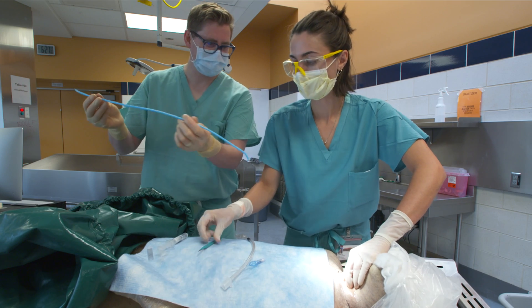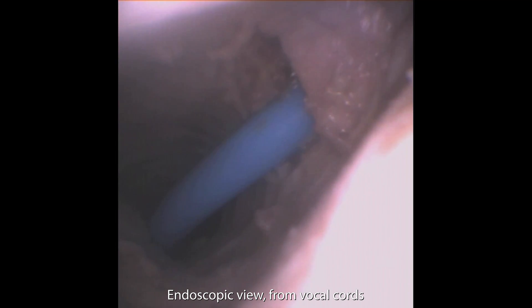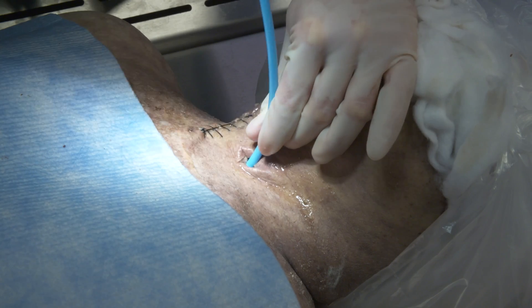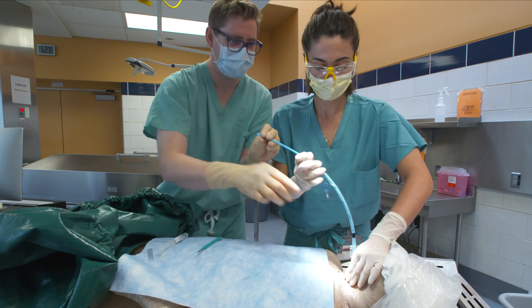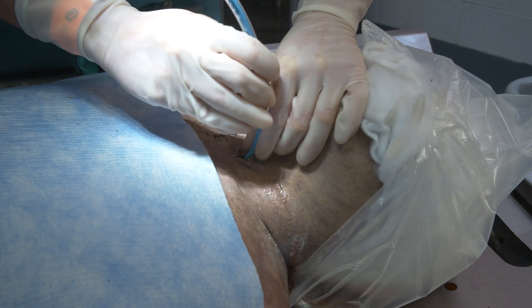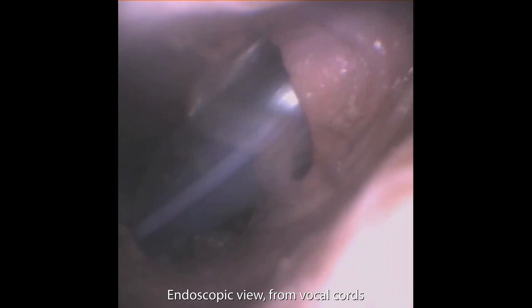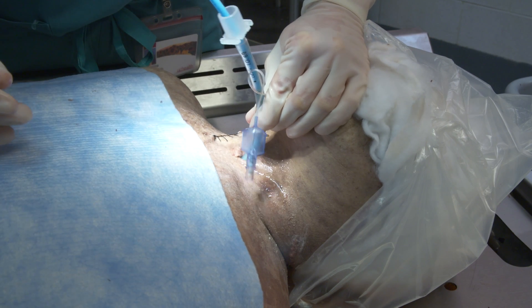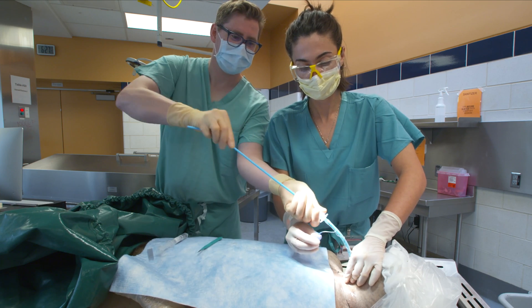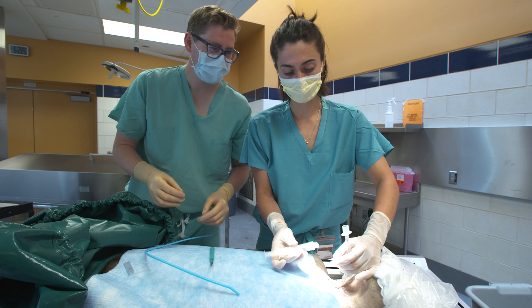Next, insert the bougie into the incised membrane and advance it at least 10 centimeters or about 4 inches. Holding the bougie at the level of the skin, advance the endotracheal tube over the bougie and into the airway. This will require firm pressure and sometimes a twisting motion. Advance the tube into the airway about 4 fingerbreadths or 8 centimeters. Holding the tube securely, remove the bougie, inflate the endotracheal tube cuff, and ventilate the patient.